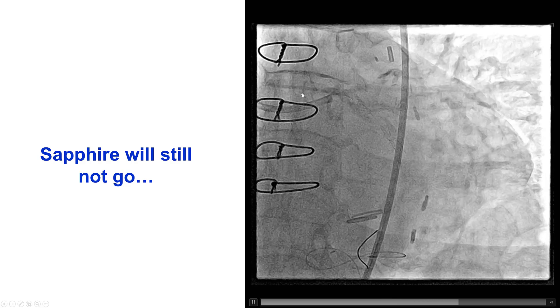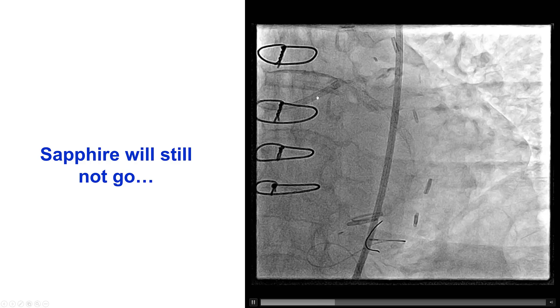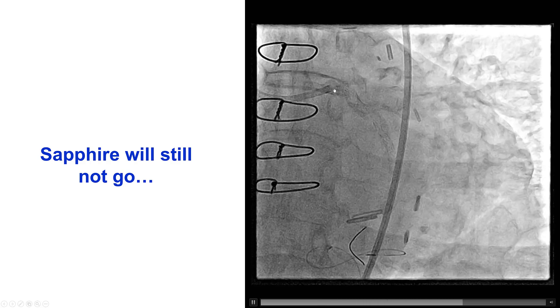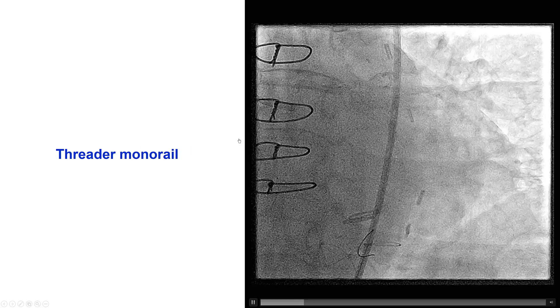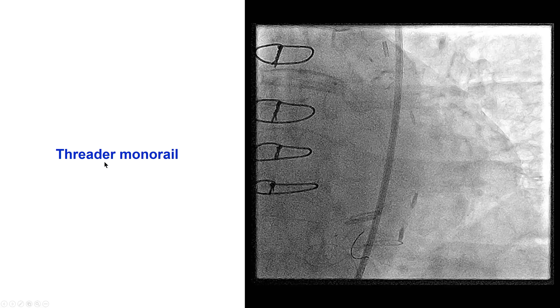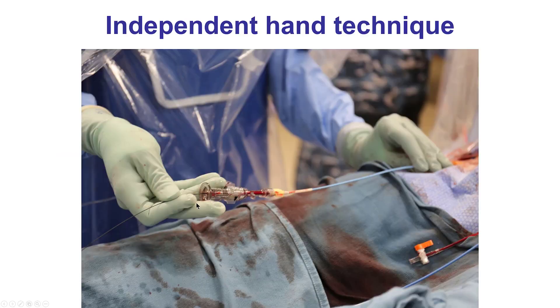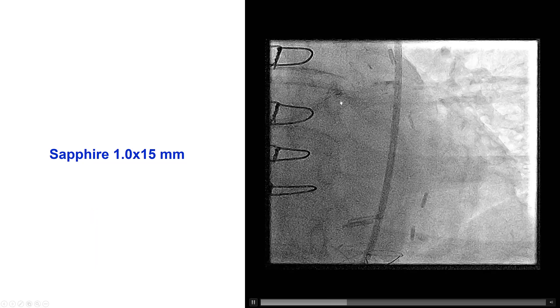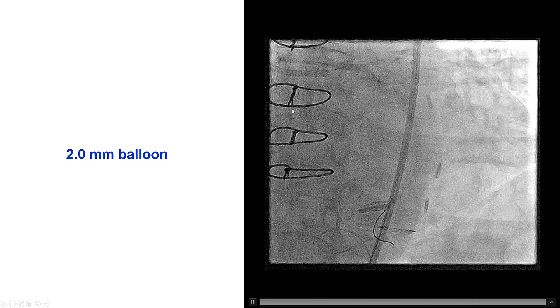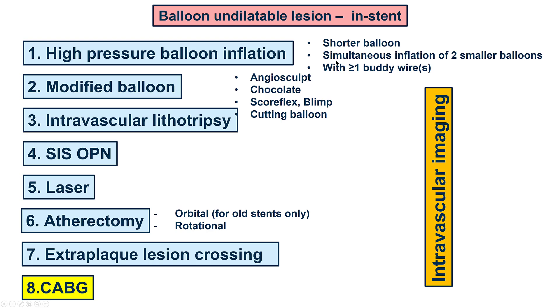Unfortunately, the Sapphire balloon still would not be delivered — it appears the tip was catching on the plaque. Fortunately, after a lot of effort, we were able to advance a threader monorail balloon, which finally took the bend and went into the left main. The critical technique here was the independent hand technique: the left hand pushes the guide providing strong support while the right hand advances the balloon. After the threader, the Sapphire could also be delivered into the left main, and then it ruptured, but we were able to advance a 2.0 mm balloon and balloon the left main.